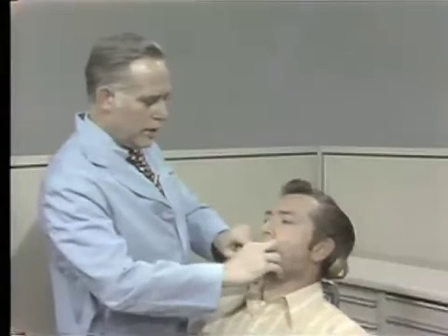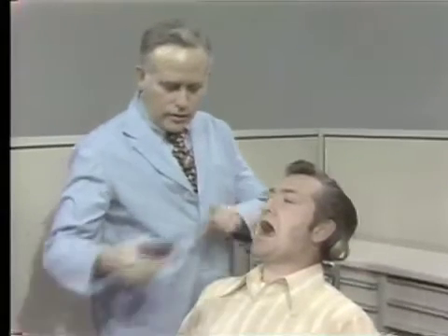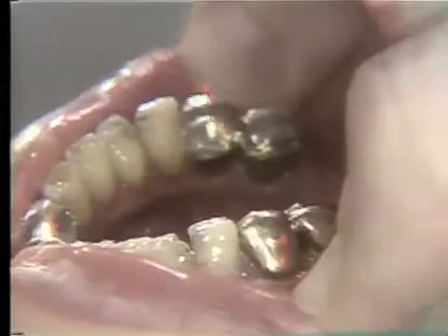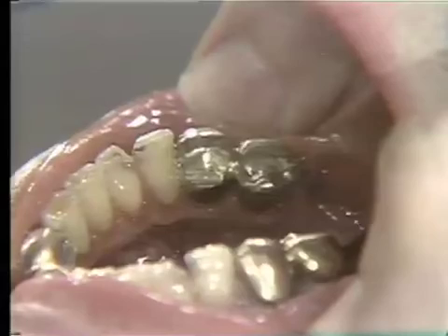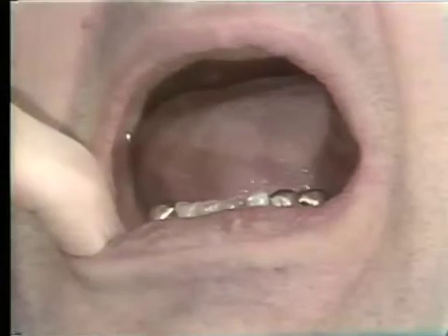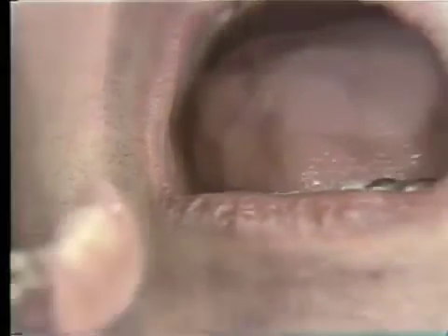Below, we have a class 1 partial denture with free end saddles, which is anchored on the left on the first bicuspid, which is splinted on the left to the cuspid. On the right, we have a full crown, and the partial denture utilizes wrought wire clasps.